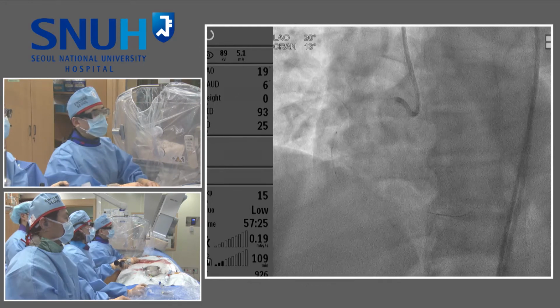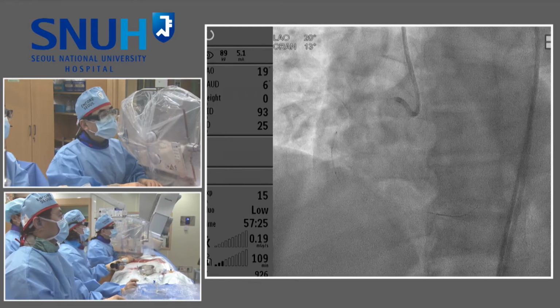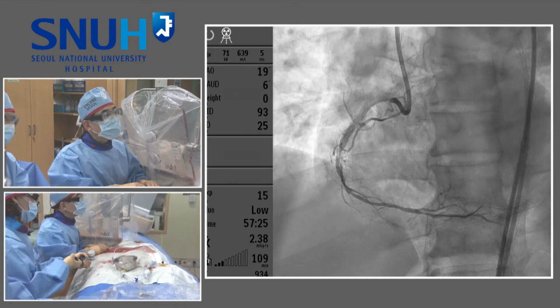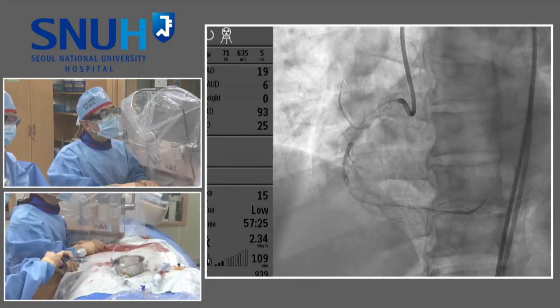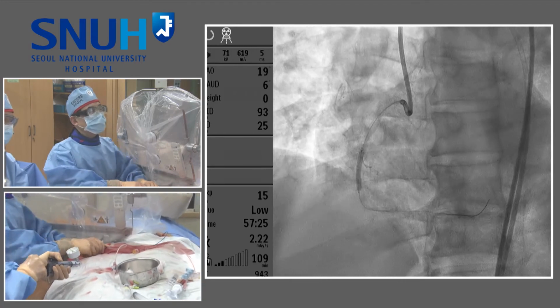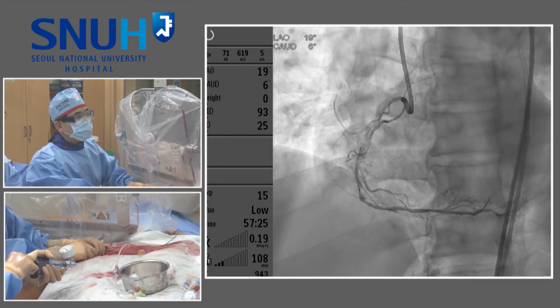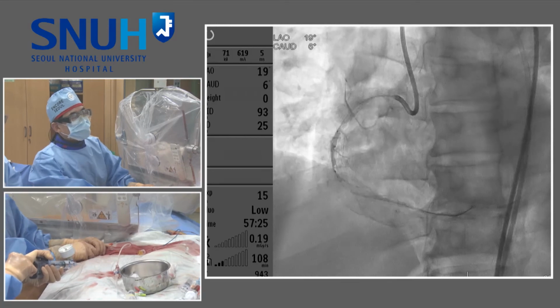Okay, Dr. Kim, time is over. Okay, inflation. You have 1 minute to show us the results after the stent. We want to see just the branch. We want to see whether Dr. Hong is going to be satisfied.